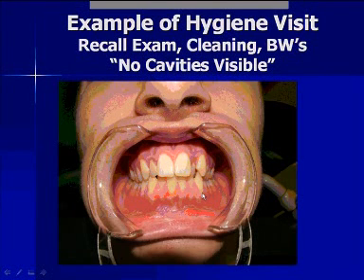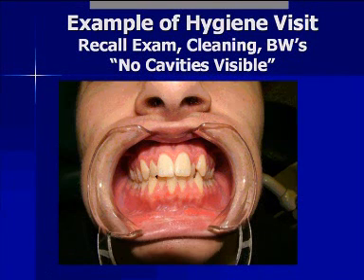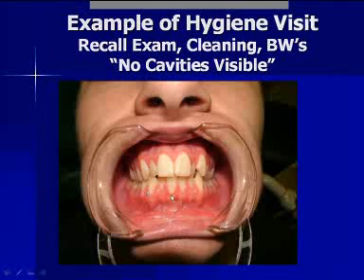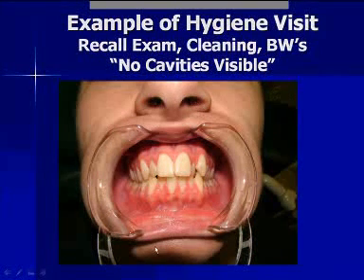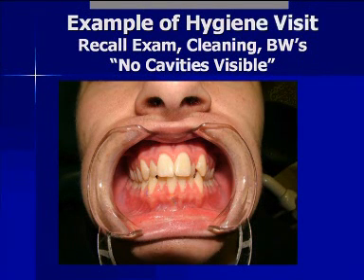I see a dental crossbite. I see some recession starting, and this is a 15-year-old. There's premature recession already occurring here on the lower incisor. Oral hygiene's not perfect, but I wouldn't blame the recession in this case on the plaque buildup. This is definitely a heavy contact. And the same thing with the cuspid. If you look on the left side here at this cuspid, the recession is starting.